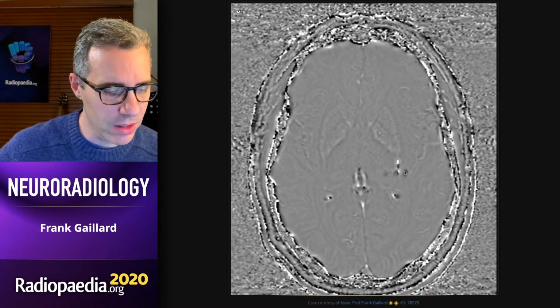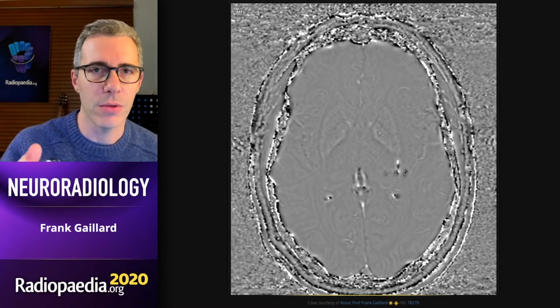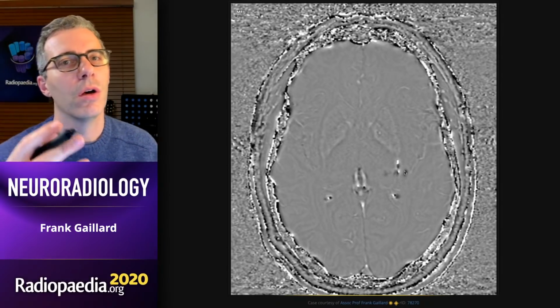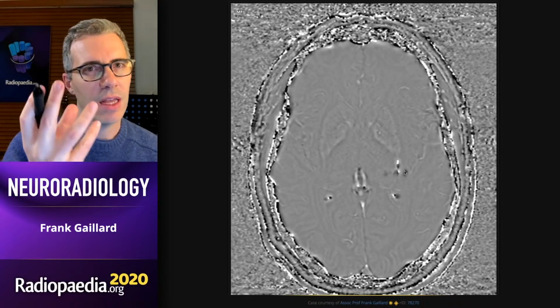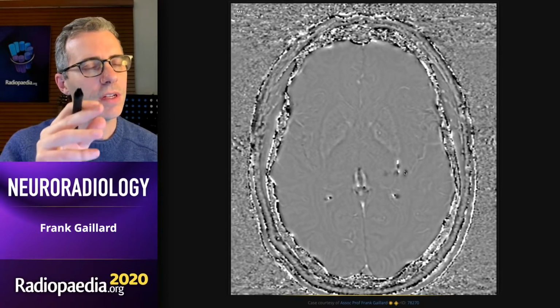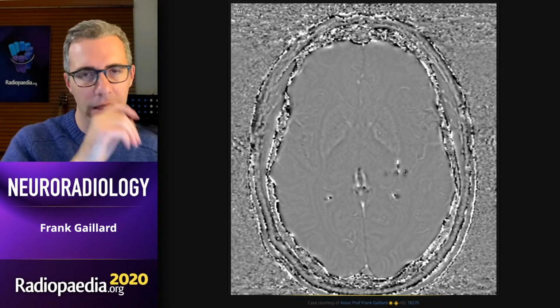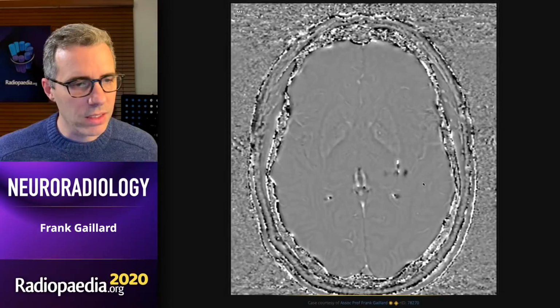I remember years ago when I was still a general radiologist, when you do ultrasound and you're trying to examine a flowing vessel with Doppler and you set the range too low so that the waveform exceeds the upper margin of your range, then you'll get aliasing. And this is the same thing that's happening here. When you have a large clump of hemosiderin or calcium or whatever, if it induces enough phase shift that you wrap around, you end up appearing to have gone the other way around. And so you'll get aliasing and you'll get the sharp transition between black and white.